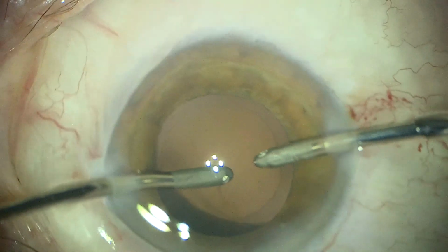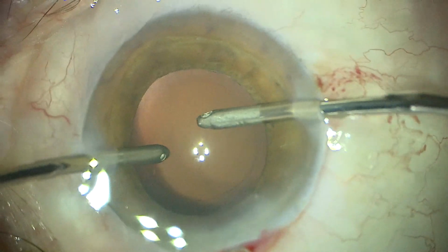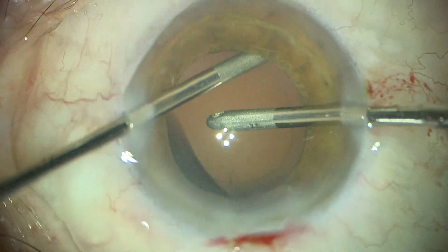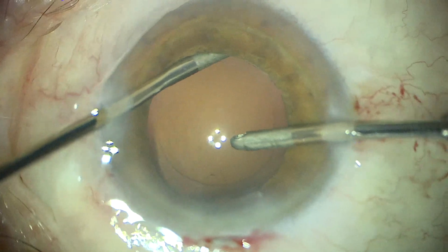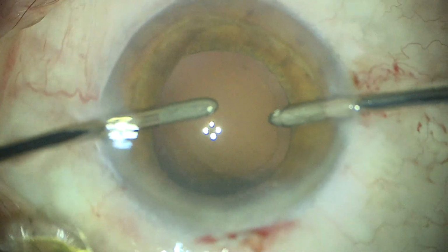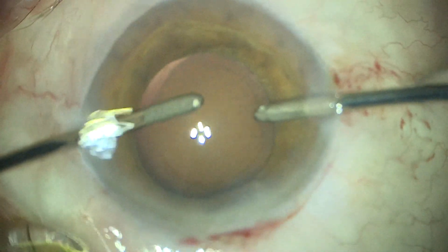If there are some residual strands of cortex, we don't have to waste too much time and energy. We can first implant the lens that will stabilize the periphery of the capsule, and then easily continue with the aspiration of the last fibers.